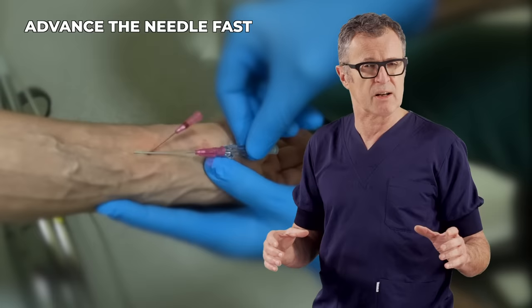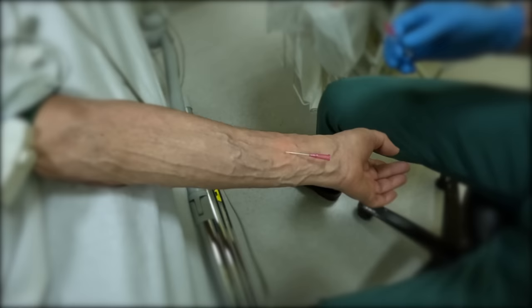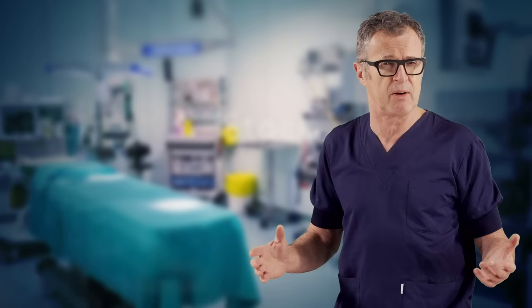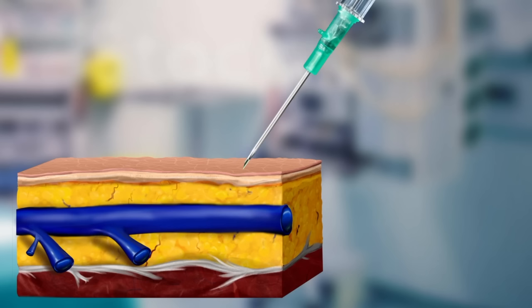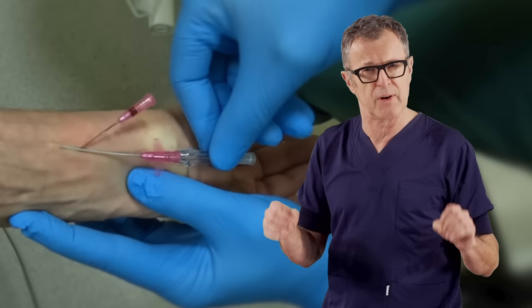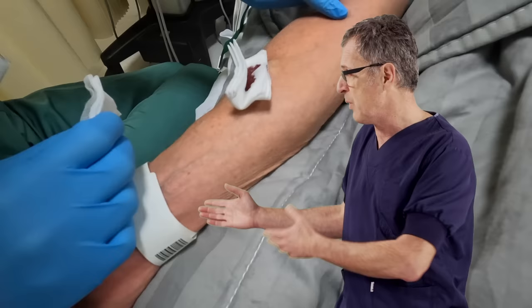Likewise, advance the needle fast to penetrate the vein instead of risking the vein rolling off with slow speed. Here you can see how pulling the skin distally instead of side by side works better. We can also see that the first catheter now has some blood in its lumen. This suggests the first practitioner did go through the vein, but because the lumen of the vein was diminished by side-to-side stabilization, there was no blood return in the hub of the needle as an indication of intravascular placement.